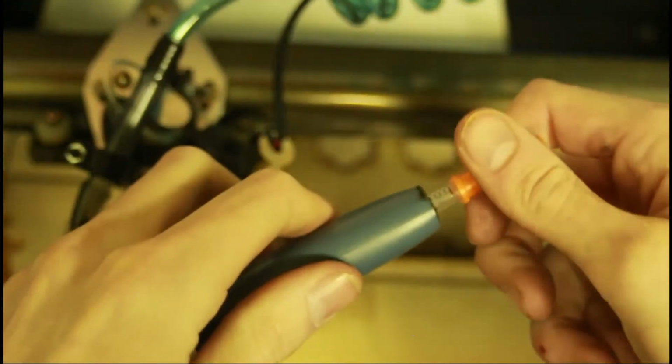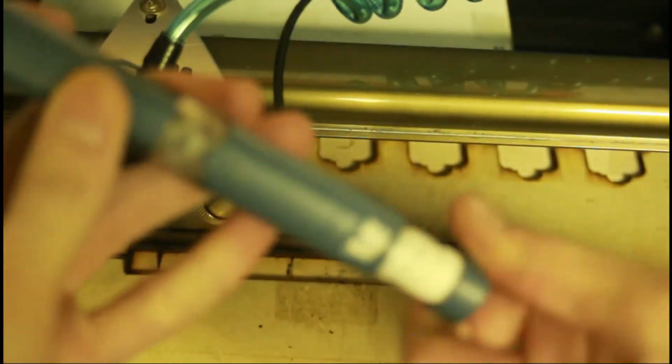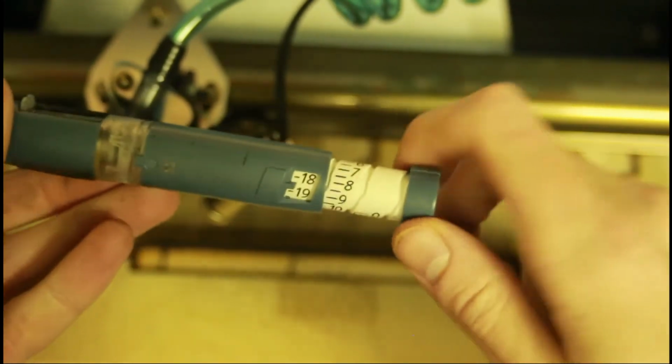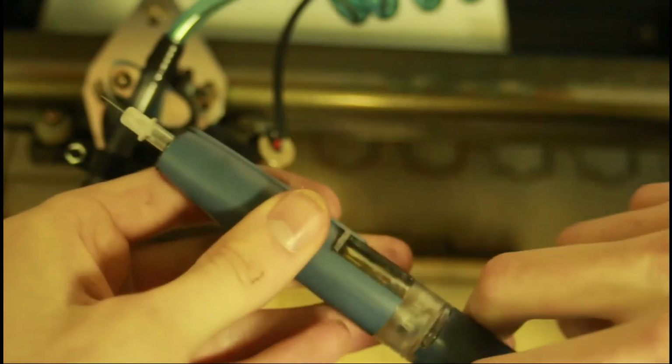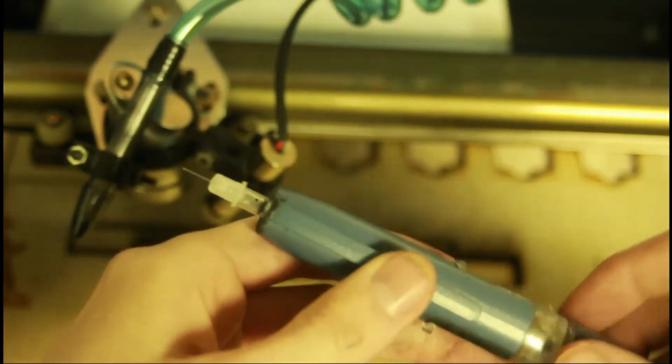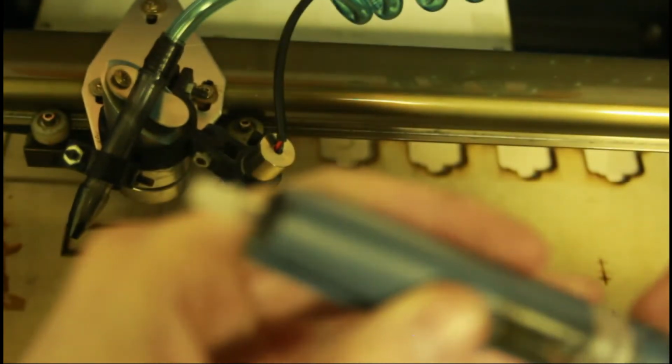Twist and click. Then we'll open it up. Give it a few units just to get to the point where we can see it. Keep in mind, this blue one does half units, so you can only go up to 30, right? We'll take it up to 30. All right, now you should see the plunger right there. Right now it's at just about 3 units, a little bit more.